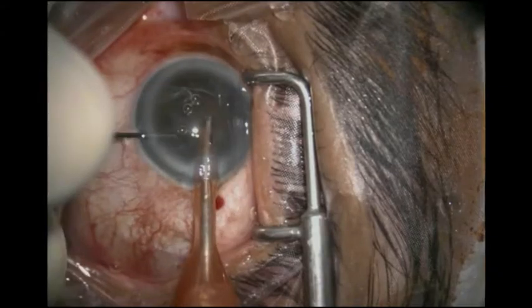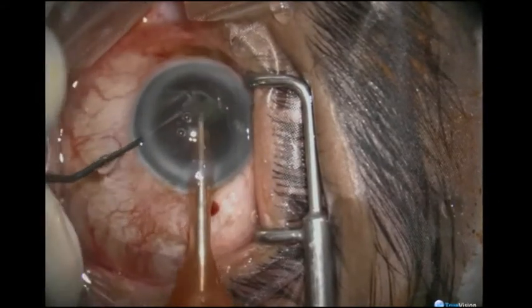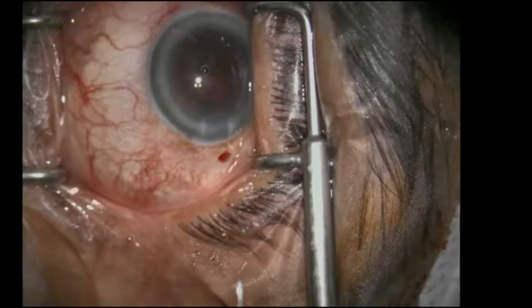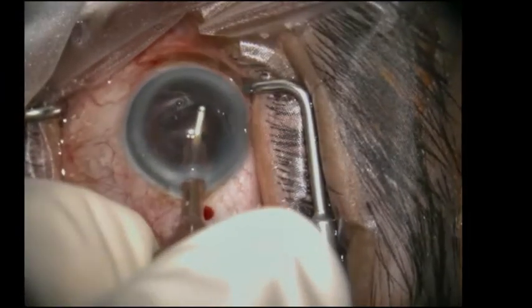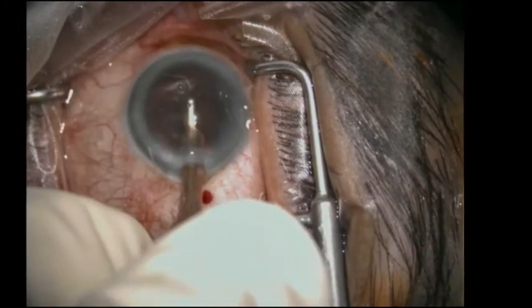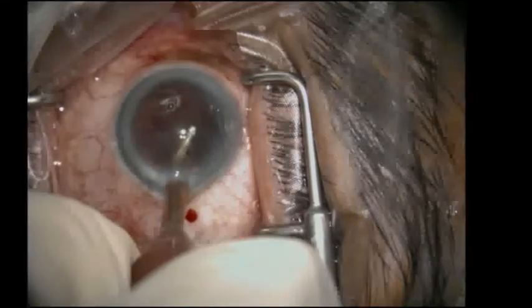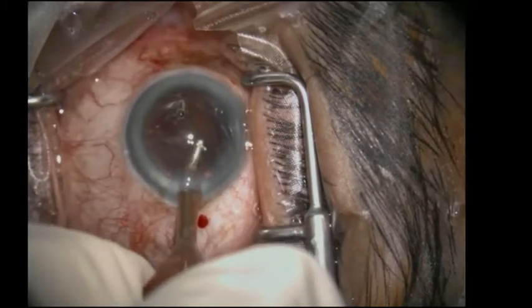In this video of fluid misdirection syndrome, the nucleus emulsification proceeded normally. It was during irrigation aspiration that the pressure started rising. The AC became shallow and it became difficult to continue. There was a risk of PC rupture and related problems. It was decided to stop IA.